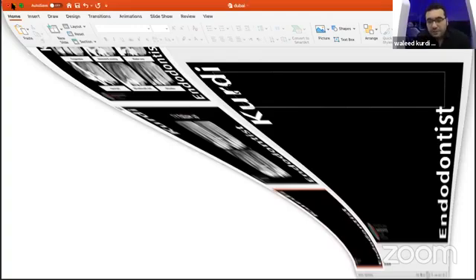I see that ledge cases are too difficult to deal with when combined with main canal calcification. How to cope with such cases? Same protocol, yes, indeed. Ledge cases with a calcified canal are not easy to deal with, but with the same protocol, if you cannot make the right way to the apex, or even to drill inside the canal along the right pathway up to the apex, we always have this last option of surgical intervention.